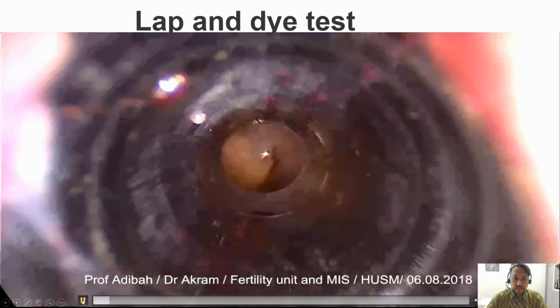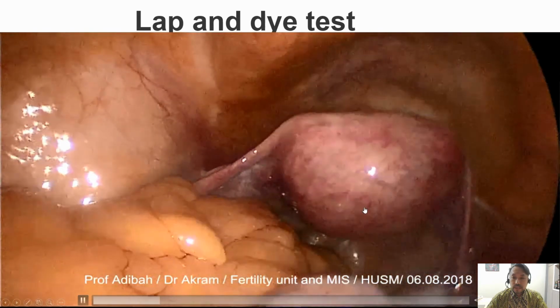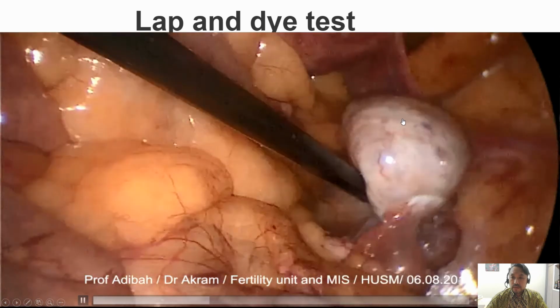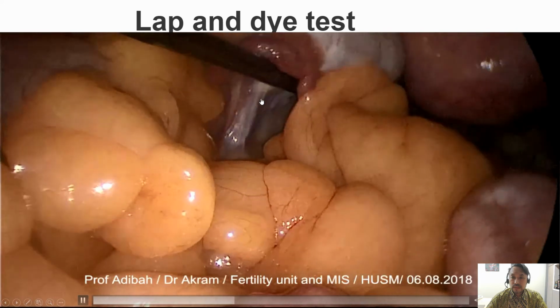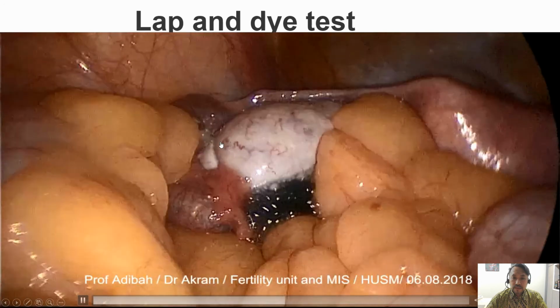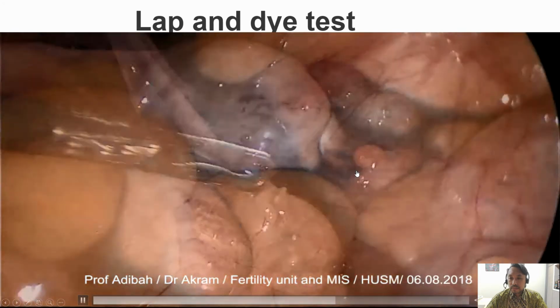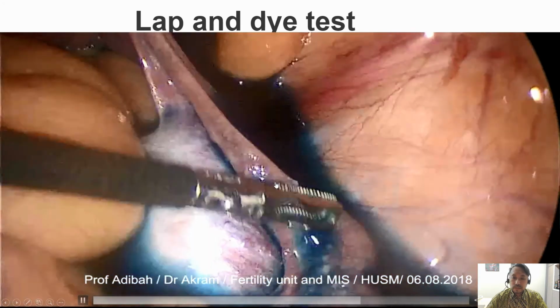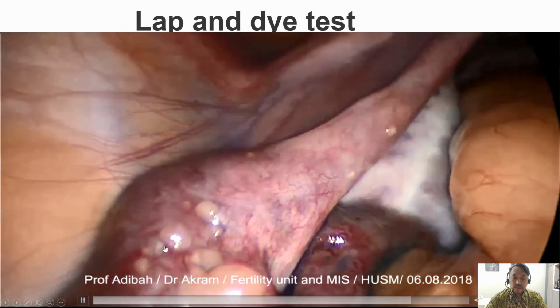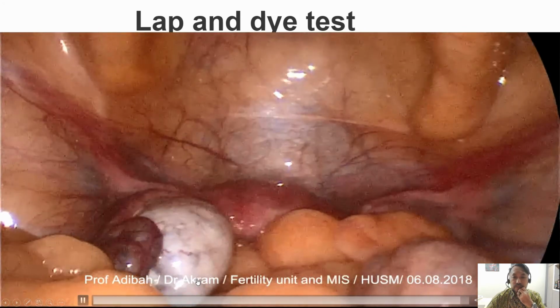So this is the laparoscopic view. You can see the uterus here. This is the ovary. On the right side is the ovary, this is the left side of the ovary and tubes, and then injection of the dye, methylene blue. You can see this side is okay, and then this side is also patent. So this is diagnostic. Some bullous, vesicle types of endometriosis in this patient.